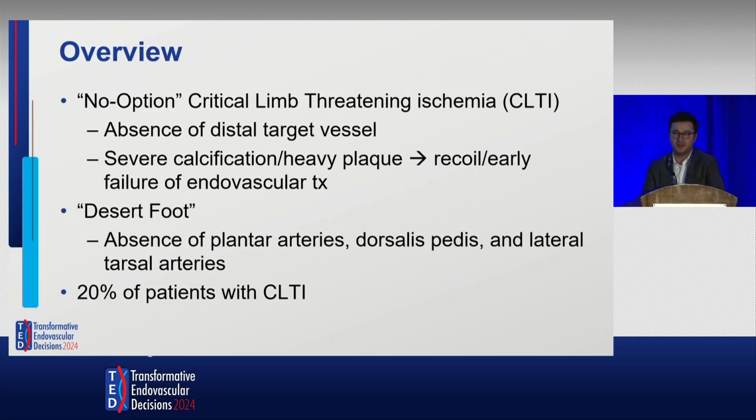So it's actually very interesting that I'm the individual who's tasked with talking about this therapy, with so many people on the panel and in the audience who have been doing this for a lot longer than I have. But when we talk about these no-option patients, we can all conjure a mental image in our heads, right? These patients don't have distal targets for open bypass, or they're patients who have really high SAD scores and MAC scores, who have severe calcification, heavy plaques, the types of lesions that we know are either going to recoil if we open them up with balloons or atherectomy, or will subsequently fail with endovascular therapy.